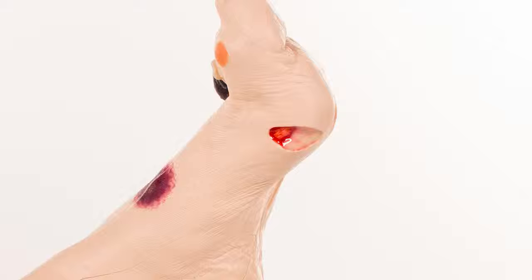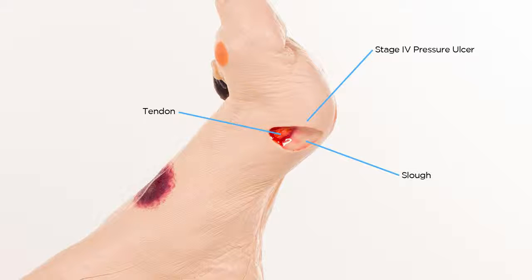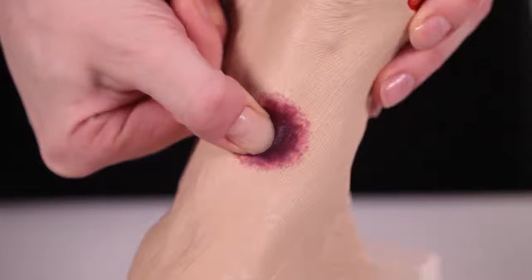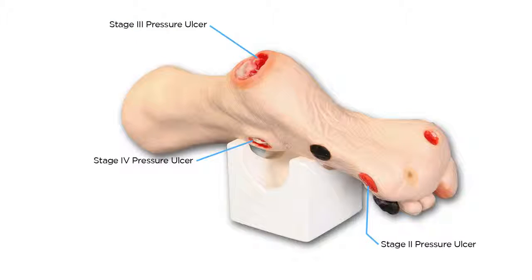On the medial aspect of the foot, another Stage 4 with exposed tendon and slough. The top of the foot displays a suspected DTI that, when palpated, has a soft, boggy feel. On the lateral side is an eschar wound.